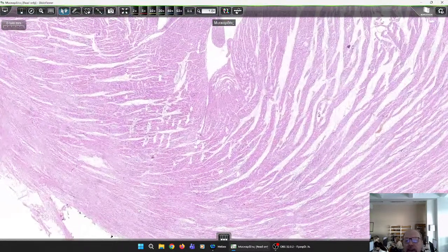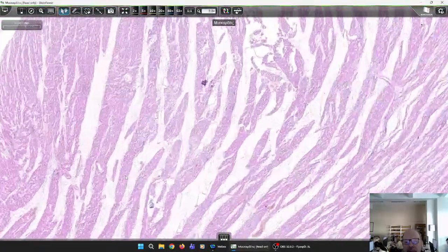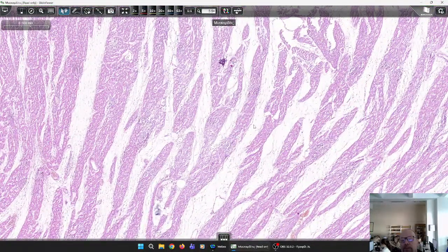Nevertheless, here we can see a sign of inflammation which is related to the increase of the distance between these damaged myocardial fibers. This is a key sign of inflammation, because here one might think that this could be fibrous tissue. However, if you perform a Masson stain, it won't stain green to blue.